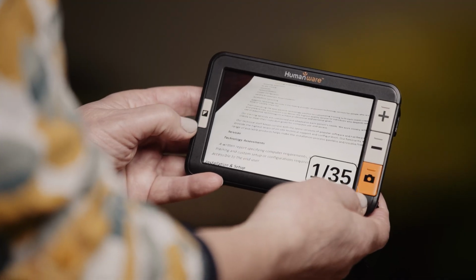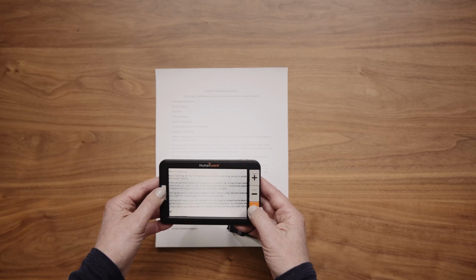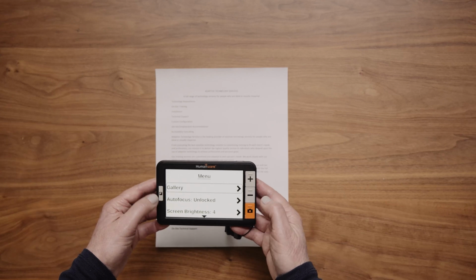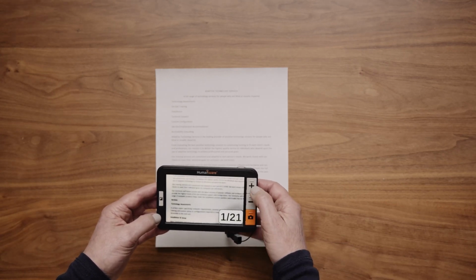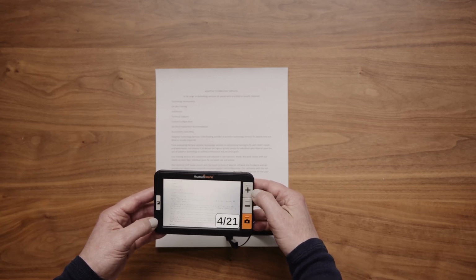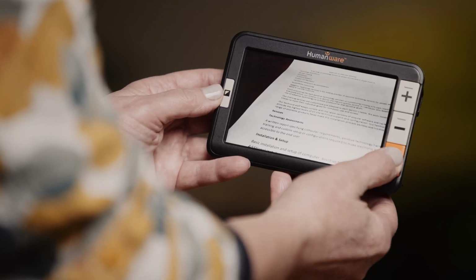Delete images. 1. Go to the gallery. Press the contrast and freeze buttons simultaneously. 2. Navigate through the images with the Zoom In plus or Zoom Out minus button. 3. Delete the image by pressing the freeze button.